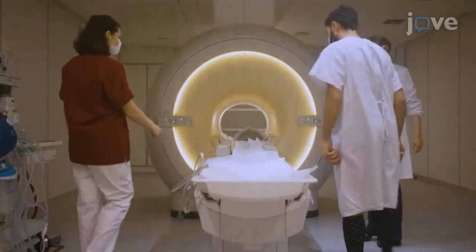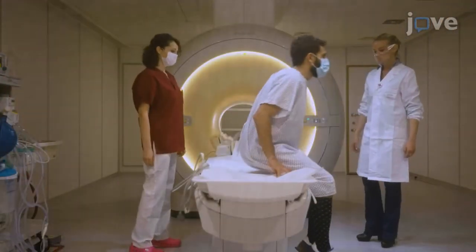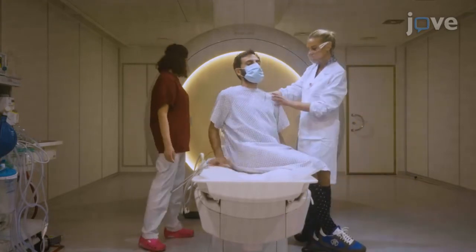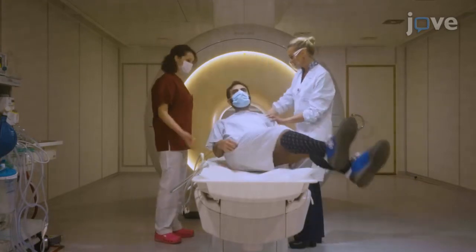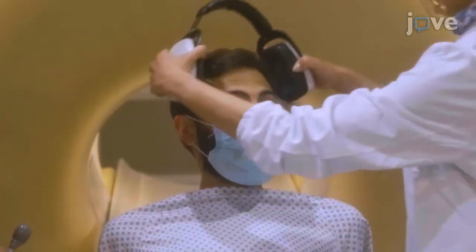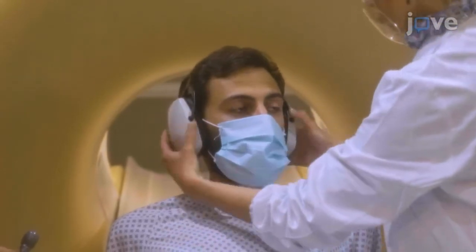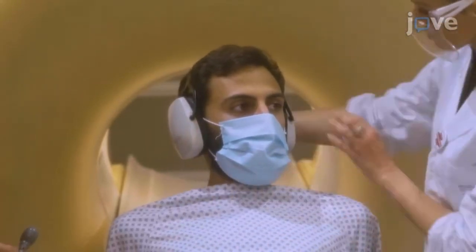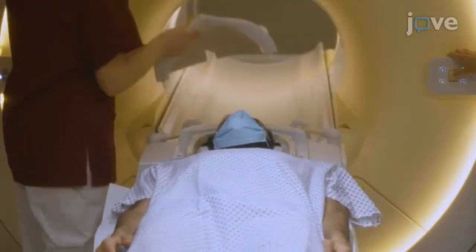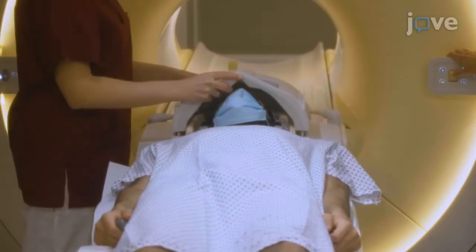Instruct the participant to lie down in a supine position on the bed of the 3 Tesla MRI scanner. Provide ear plugs and headphones to block noise, and place a radio frequency coil over the participant's head.